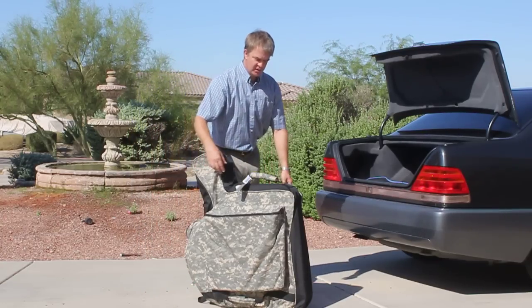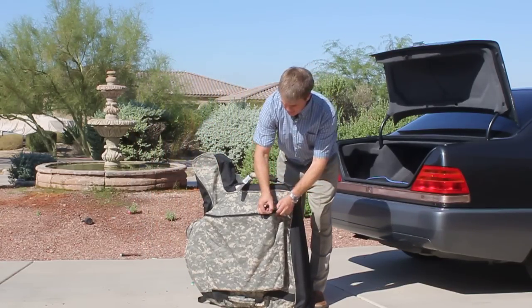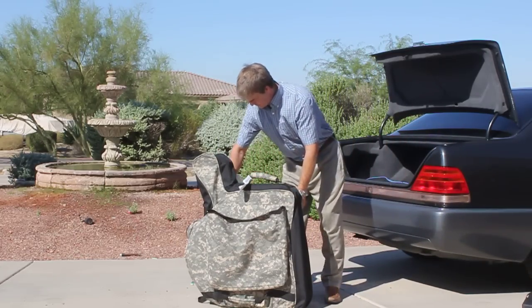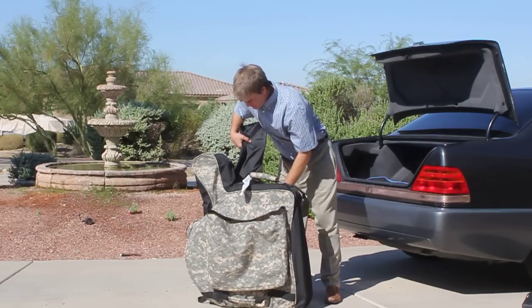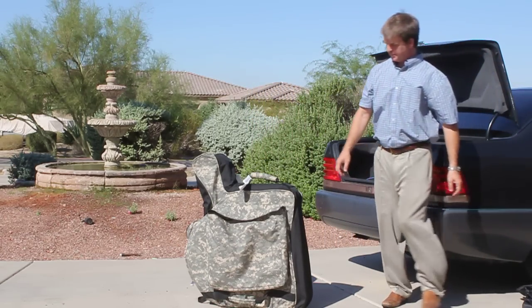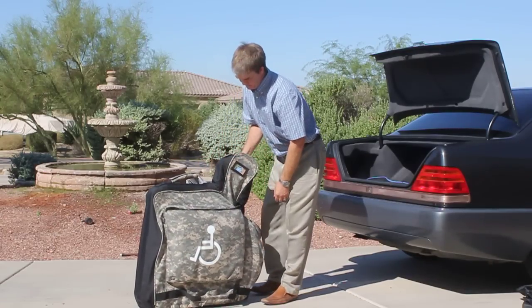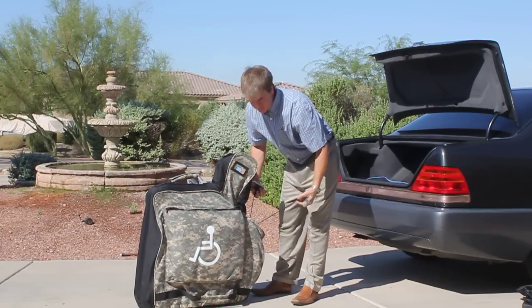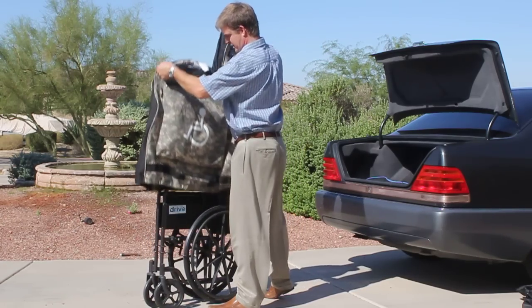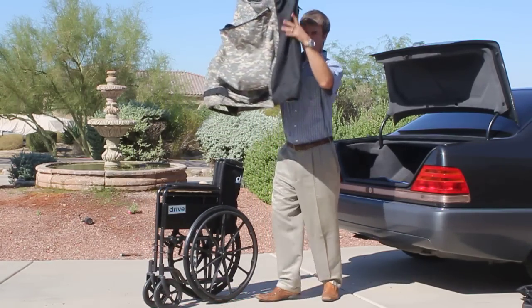In order to, when you're all done, take your wheelchair cushion, both of your leg risers, then you simply push the rope clutches and it comes right off.